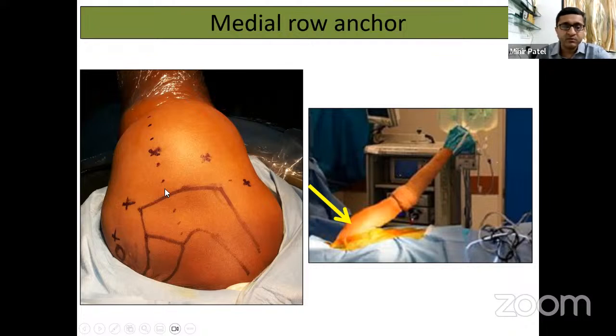And the points of insertion will be just off the lateral edge of the acromion. For an anterior anchor, just anterior to the lateral portal. And for a posterior anchor, posterior to the lateral portal. So you can see the blue and the brown dots. That's going to be a portal from which your anchors are going to be inserted percutaneously at an almost 90-degree dead man's angle.